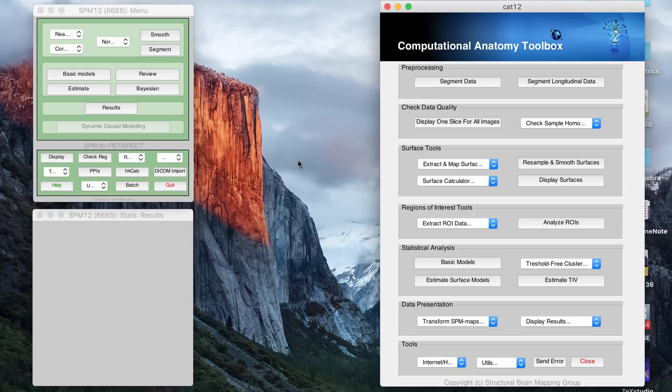Hey guys, in this video I wanted to go over how I do VBM or voxel-based morphometry. The first thing I want to get to is all the programs that I use.